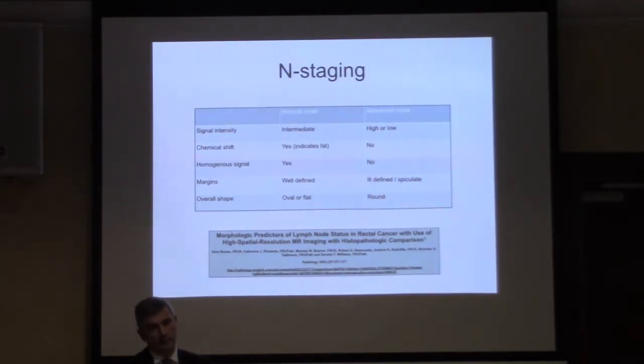So they had pathology and MRI of pathology correlates. So they could look at on a section how a bit of tumour infiltration would appear on the MRI. And they could say, when I see that, I know it means this. So it revolutionised really our ability to understand tumour and MRI appearances.